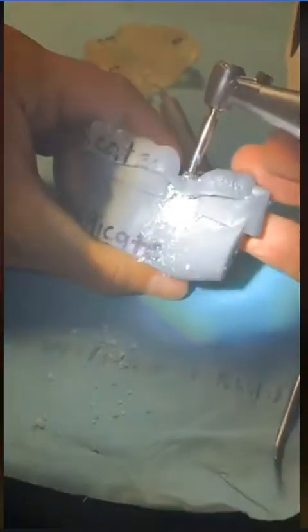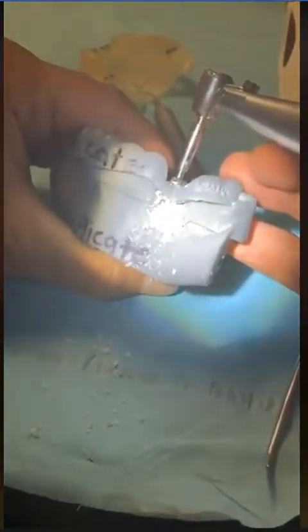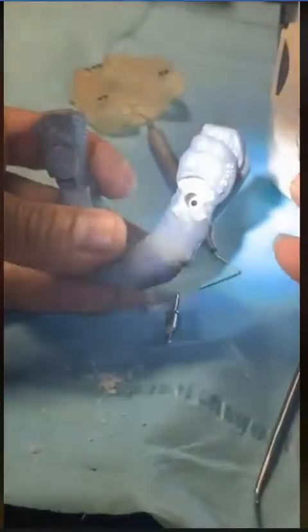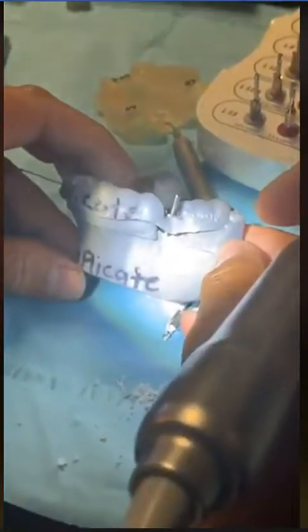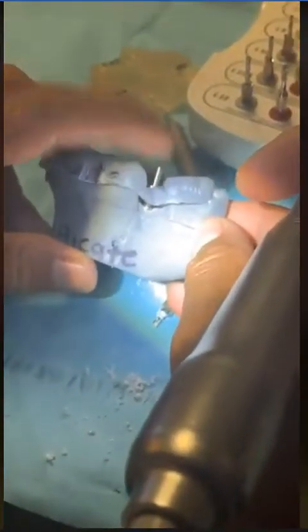Now I can seat it all the way. You see it's seating all the way? Take a look. You see that? Now, generally speaking, what I like to do at this point is I take one of my paralleling pins and put it in here and take an x-ray with it in the patient's mouth.